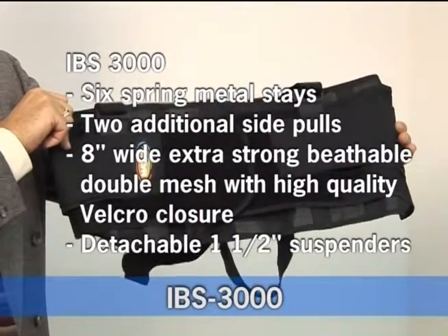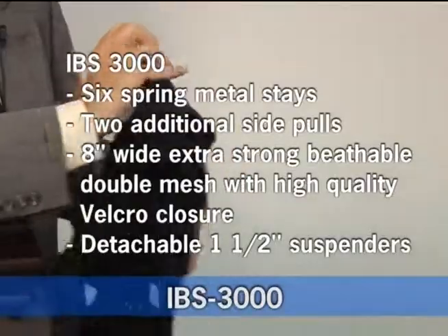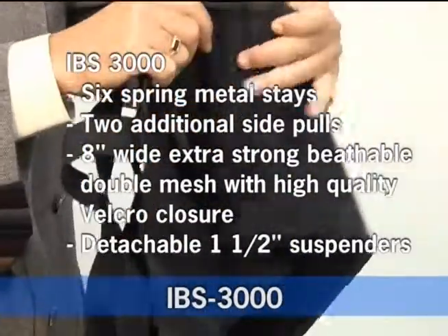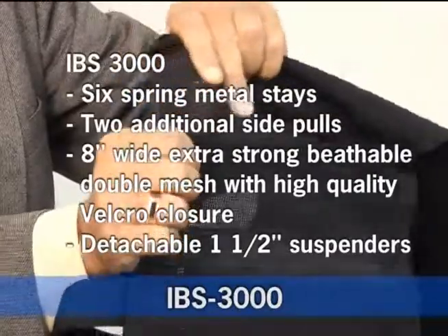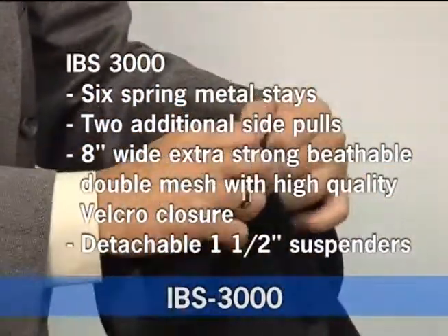The IBS 3000 is our deluxe model. It has six metal stays and two additional side pulls that provide increased stability, better fit, and tension adjustment. It has an eight inch wide strong breathable double mesh, which provides very strong, very high quality. It has a velcro closure.